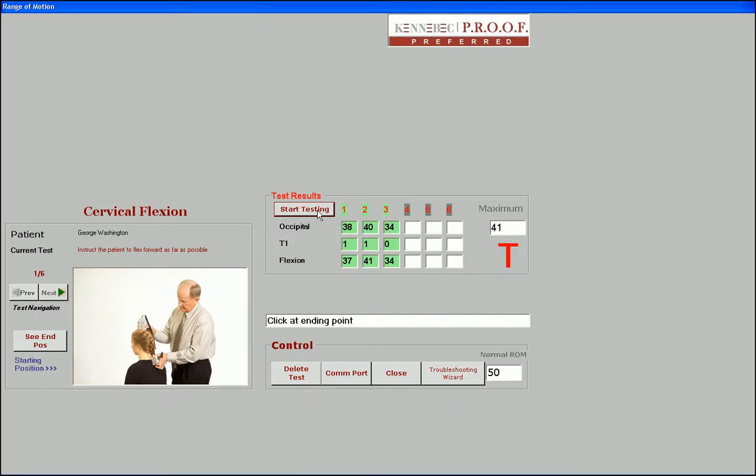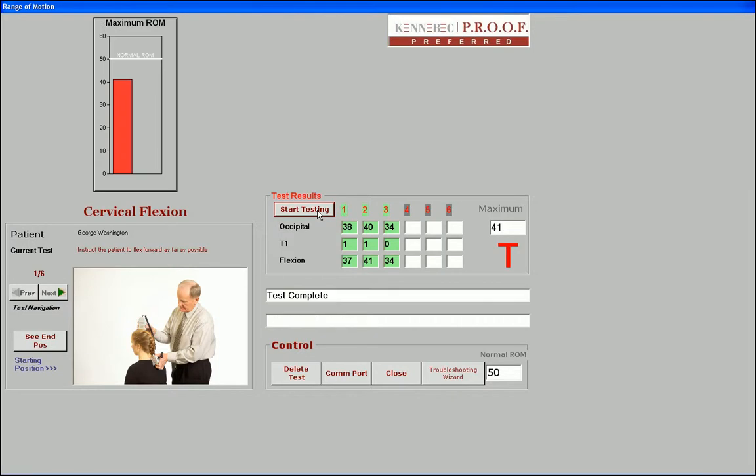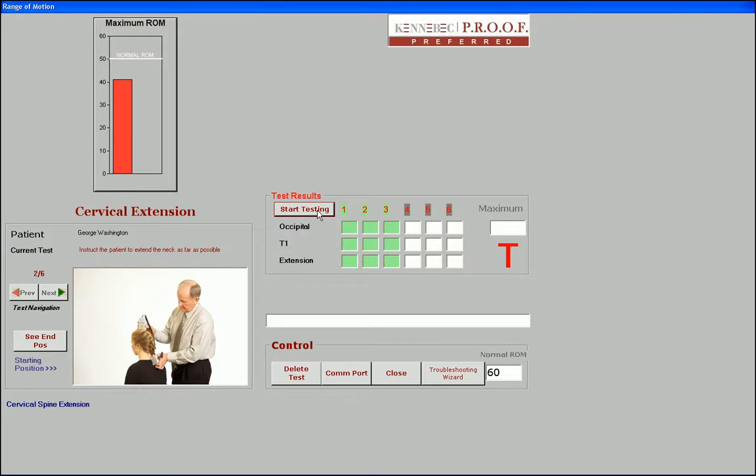After performing a set of three valid tests, the software acknowledges a successful completion, and will move you automatically to the next test. Once you're done with the testing, simply click on Close.